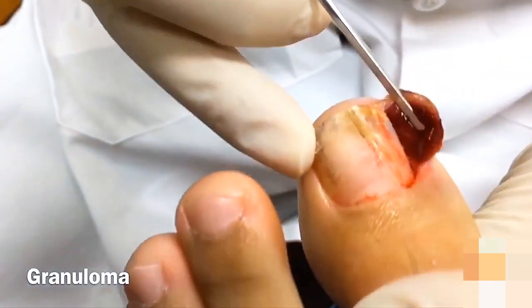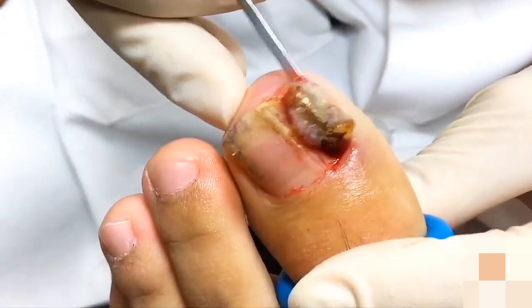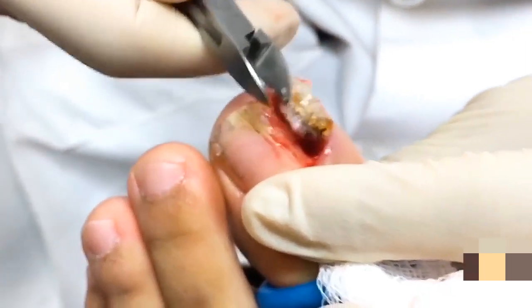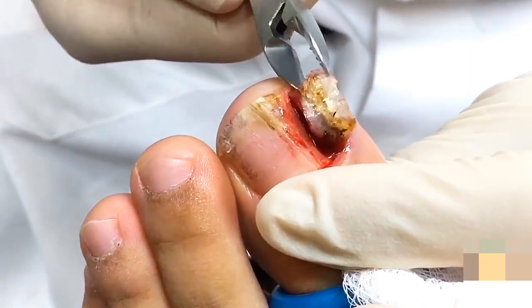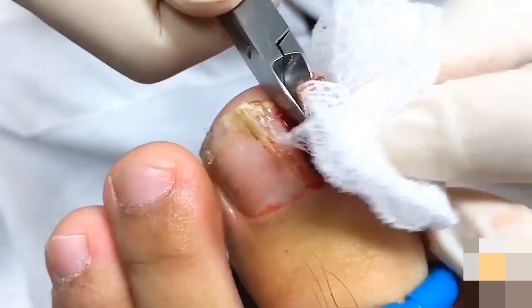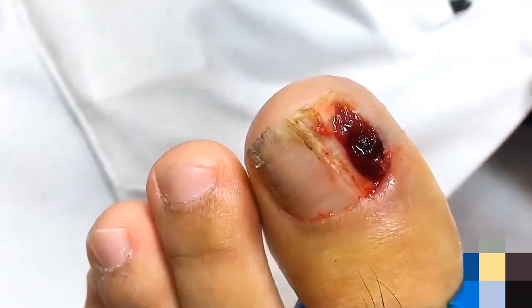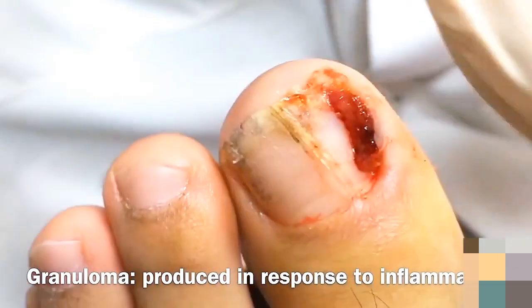This is called granuloma — it's a big skin growth. I'll take some of it; I don't have to take all of it. I'm going to take some of that so that it looks pretty decent afterward. It's blood. It's called granuloma — it's a reaction of your skin to protect itself.